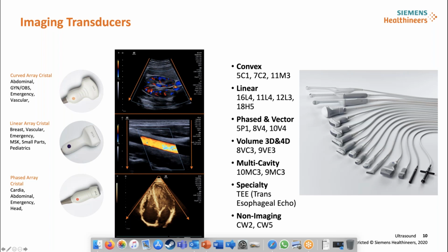It's like if you clean the screen of your phone with a very strong product, maybe it will make it very bad. So you have to know which product to use, and for those products, we did the comparison with the ones that are approved by this US website to be used against COVID-19. It's a small list, but with this one, you will be sure that you don't make any trouble for the transducer, and you will be sure that it's killing COVID-19 very well. So you will find this list of disinfectants on the website.